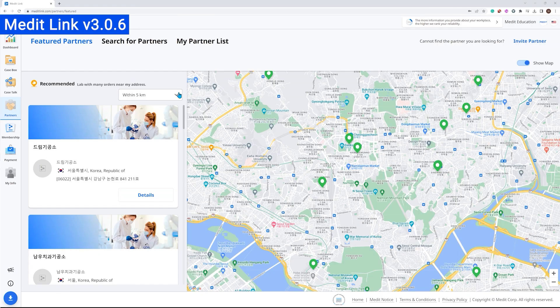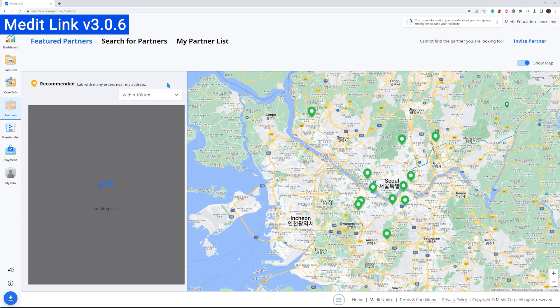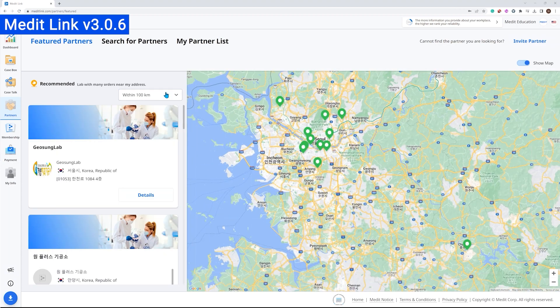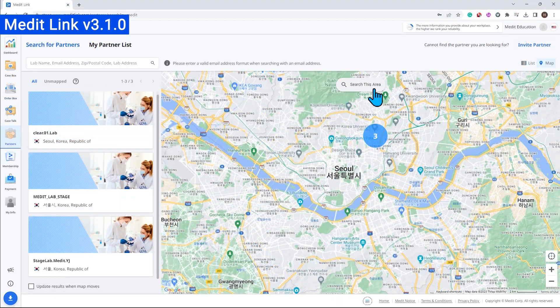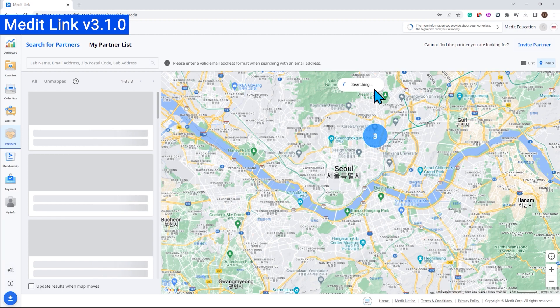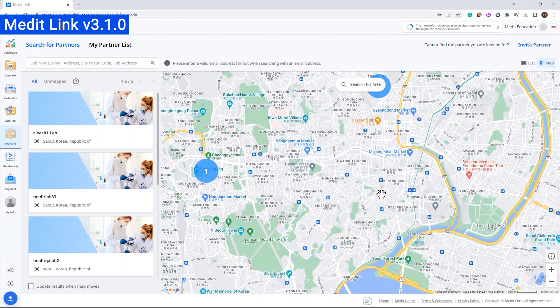Secondly, we improved the partner search process. Comfortably search for partners in the desired region and view all the search results at a glance.